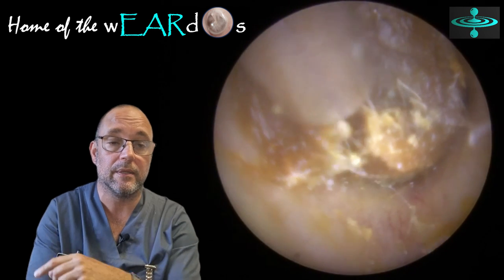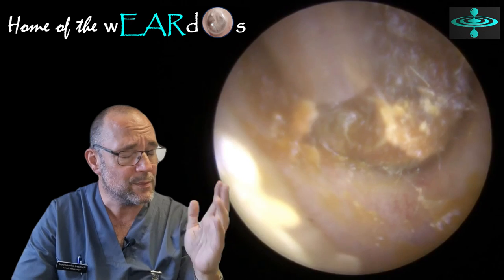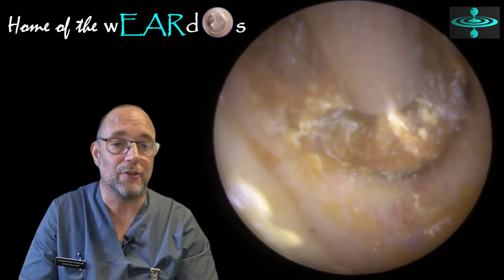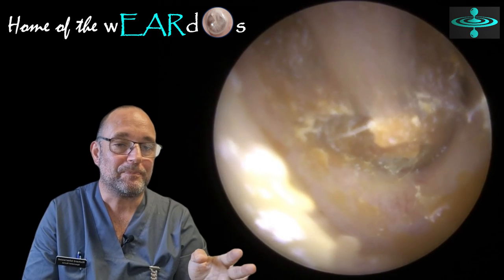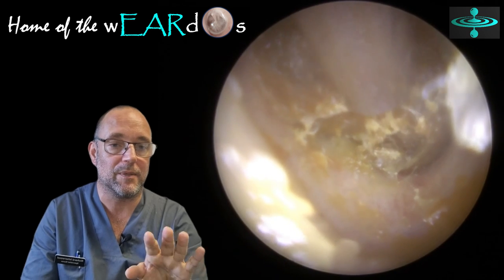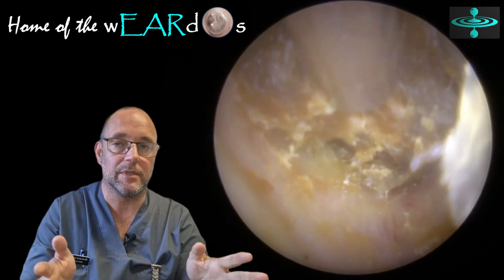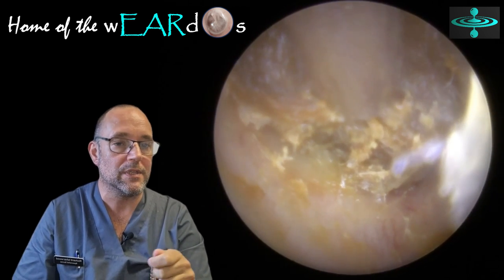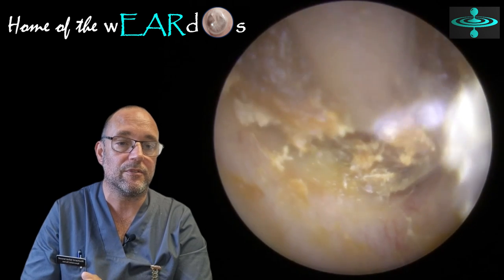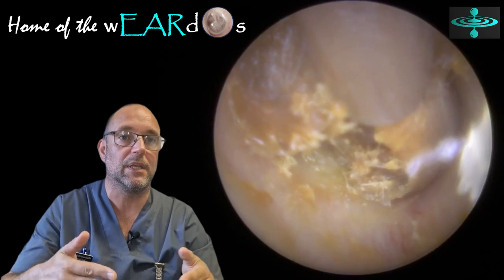It had already been oiled prior to coming here, so I didn't feel it needed any more oil. The problem was it was just stuck. For any first-time viewers — the ear canal goes narrower and then wider just before it hits the eardrum. That's the problem here: I can get a fairly good grip of it, but when you try and pull, the thing in there is bigger than the hole you're trying to get it out of. So you do these little movements, try and wiggle it side to side, and sometimes you've got to make it a little bit smaller — peel away a bit of it until it gets small enough to pull through that gap. It's kind of like an hourglass.